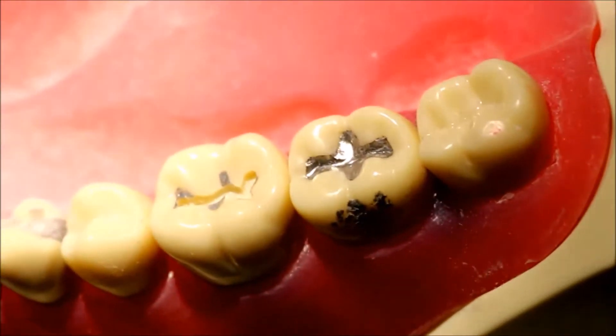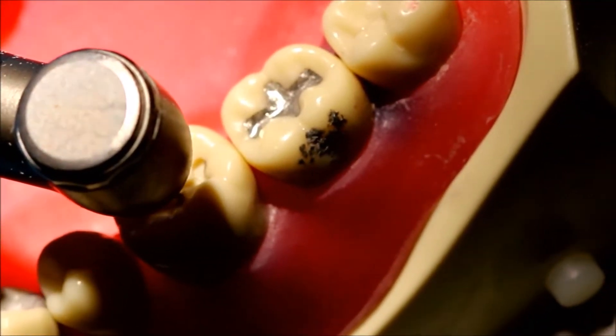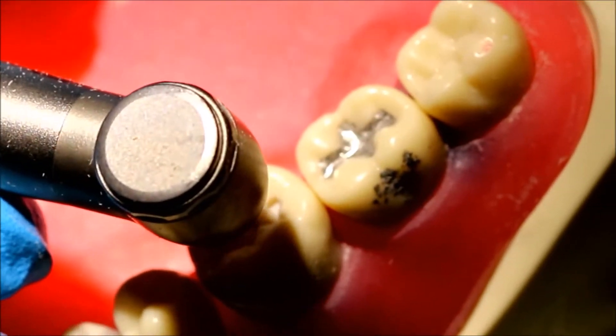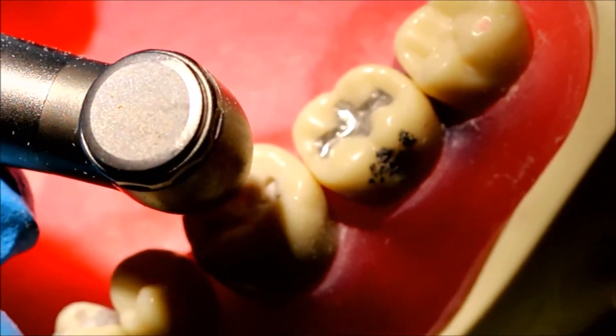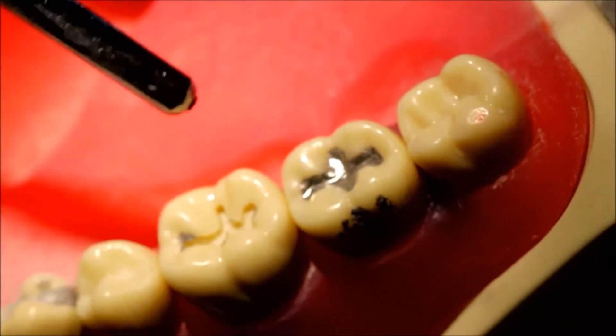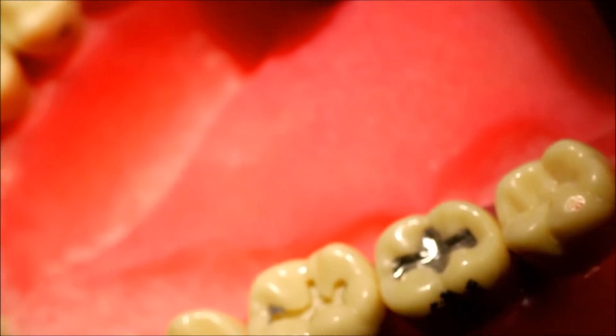It's now time to do the other fishtail extension, the buccal and lingual extensions. There's the lingual extension. Again, clean every time you make a cut, and now we're going to do the buccal extension.